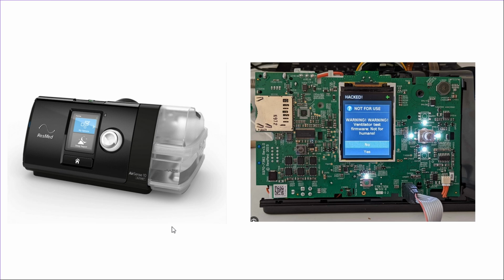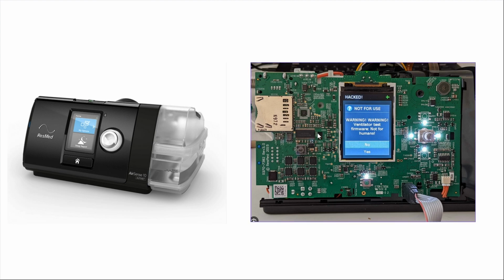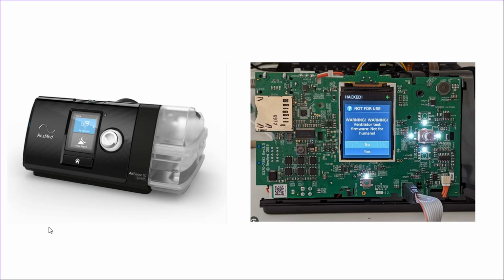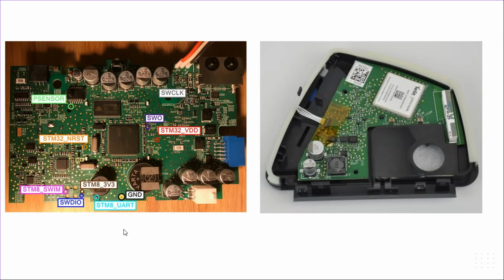So to start off, we'll be taking a look at the main motherboard that you see here. This can be accessed by taking off this front panel and removing some screws, and then you're able to get access to it. This is the backside of the main motherboard, and additionally there is another auxiliary board here, which sits on the left hand side of the machine where the intake air is for the motor.